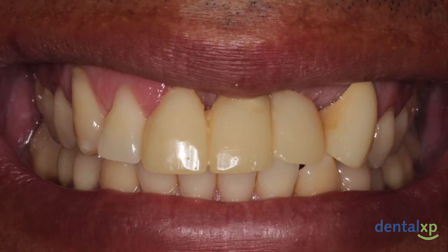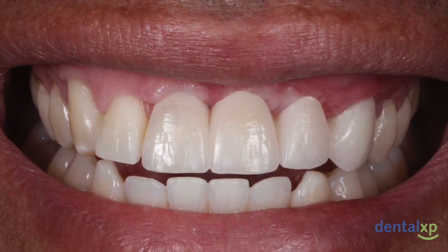And with those corrective procedures, we were able to achieve a relatively harmonious result with good integration between the white and pink aesthetics, despite the minor soft tissue discrepancies that we were left with.